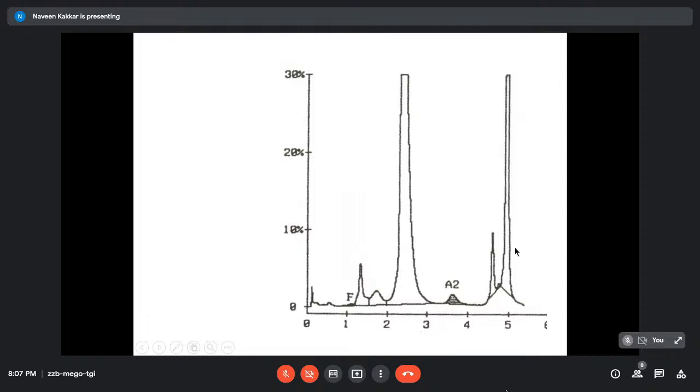So obviously this is not thalassemia. This is a new peak, means a variant. And where it is, if I drop in the retention time line, just less than that, about less than 5, so 4.8, 4.9. And this is typical for C, hemoglobin C, and this was 37.3%, and that's HbC trait, not seen in India, only about 2 to 3 cases reported.